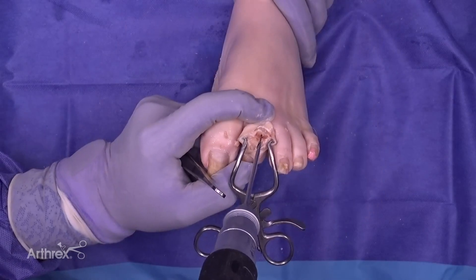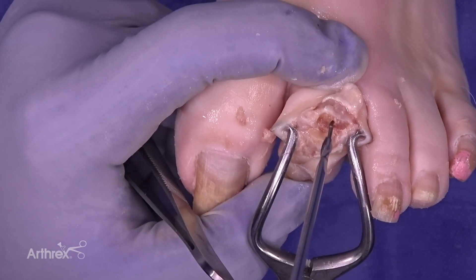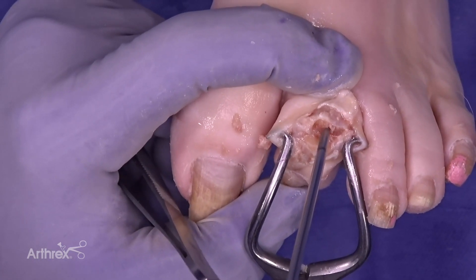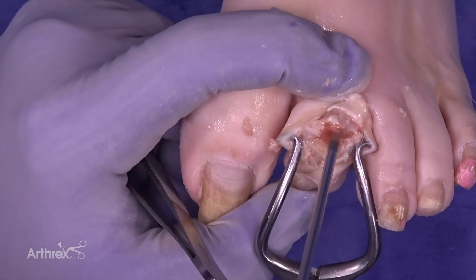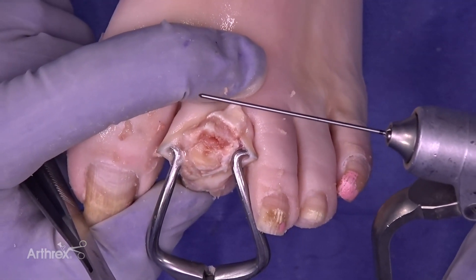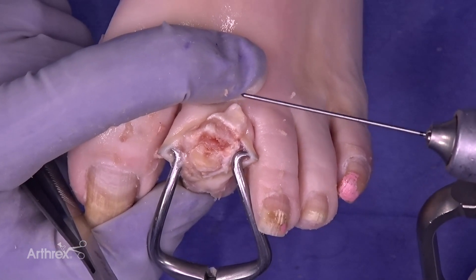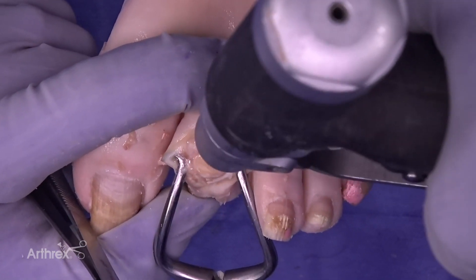Now we're going to use the 3.0 drill bit for the Dynamite hammer toe implant. At this point we are going to retrograde the malleable end of the wire at the distal tip of the digit, and we'll identify the central aspect of the base of the middle phalanx.